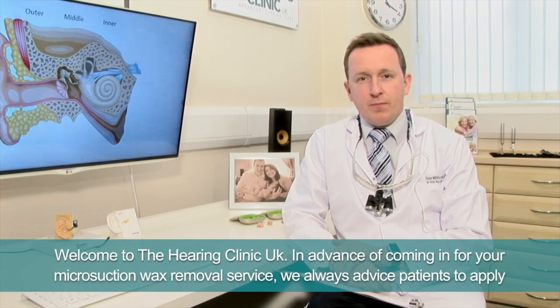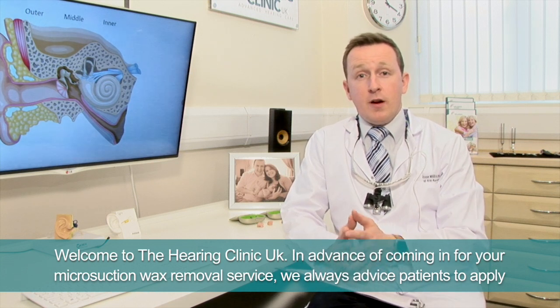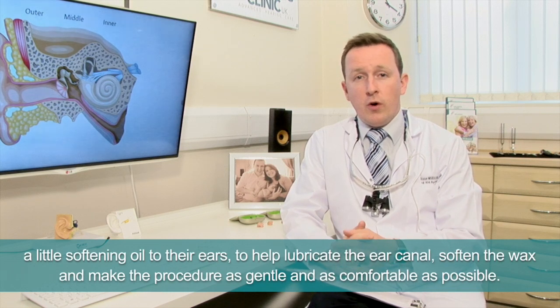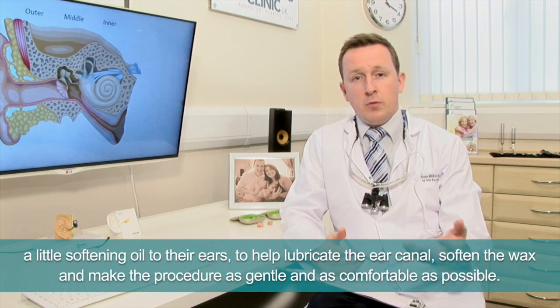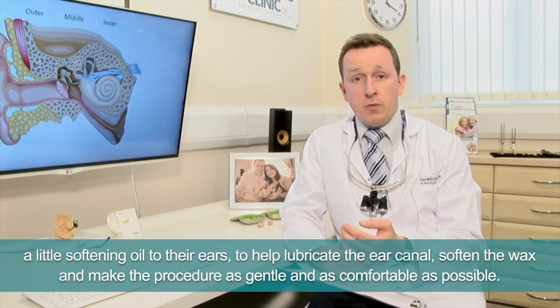Welcome to the Hearing Clinic UK. In advance of coming in for your microsuction wax removal service, we always advise patients to apply a little softening oil to their ears to help lubricate the ear canal, soften the wax, and make the procedure as gentle and as comfortable as possible.